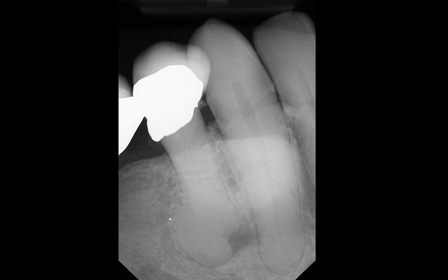Let's look at this first premolar. Once again, we have this bulbous enlargement of the root, consistent with hypercementosis. However, what's interesting is there is a round radiolucency that has apparently caused resorption of the root. You're also seeing a tooth with a large coronal restoration, and I believe this is a three-unit bridge.